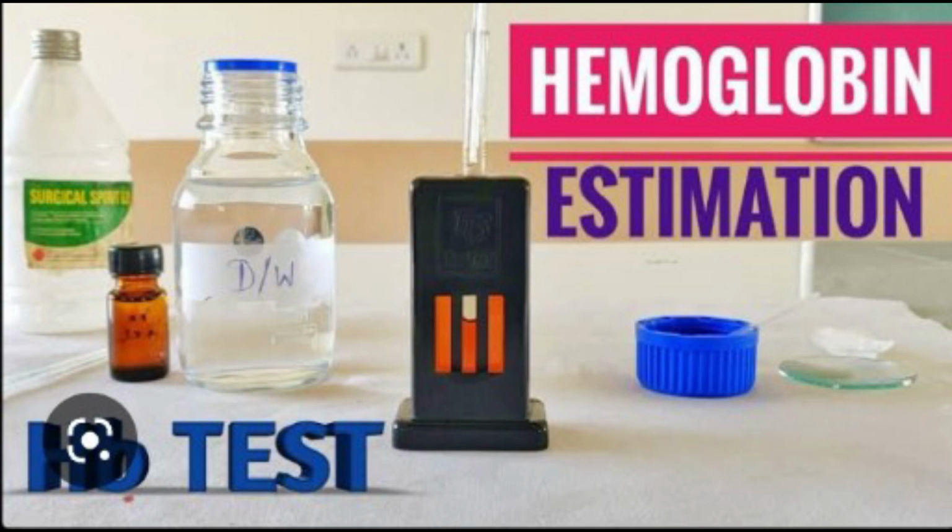Gasometric method. In this method, the Van Slyke apparatus is used for gasometric determination of hemoglobin. Blood is first saturated with oxygen. Then the oxygen is taken off and collected. Depending upon the amount of oxygen collected, the amount of hemoglobin can be calculated. For 1 gram of hemoglobin, 1.34 ml of oxygen is present in the blood. Chemical method: the hemoglobin is found out by finding the amount of iron present in the blood. The amount of iron is directly proportional to the amount of hemoglobin present in the blood.